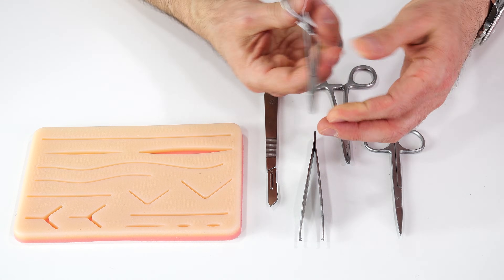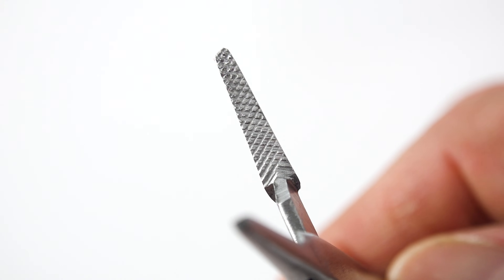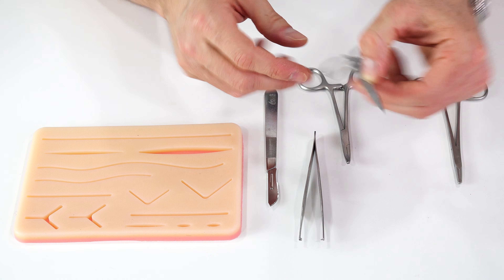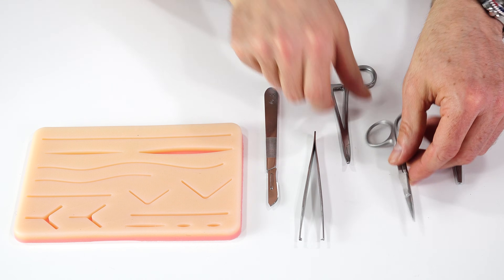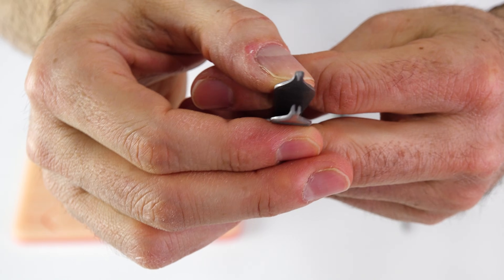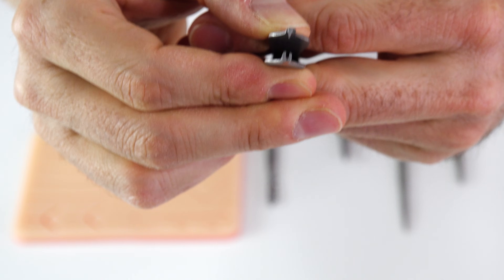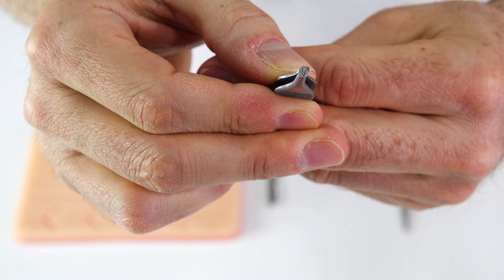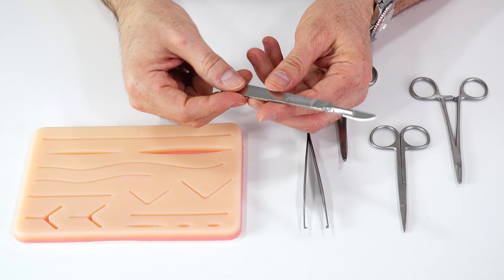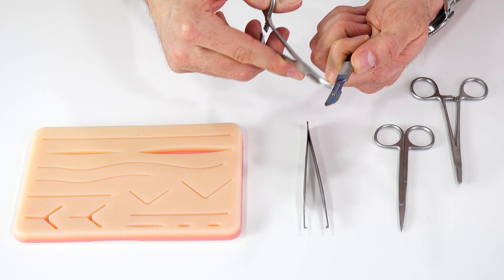Looking at the instruments: the needle driver is not bad for the price. My only issue is it has some teeth and ridges inside, and I prefer it to be flat because the needle can get placed a bit crooked — but it's fine overall. The iris scissors are fine, no issues; they'll cut sutures well. The curved hemostats are fine too. My issue with the pickups is that the teeth are big — I've used real suture kits with pickups like this and it's really hard to grip tissue and suture; I prefer much finer teeth. But in a kit at this price, this is what you'll get. The scalpel is totally fine, and for changing the blade, I recommend using a tool to take it on and off so you're not handling the knife with your hands.